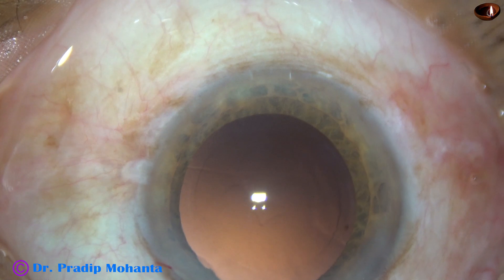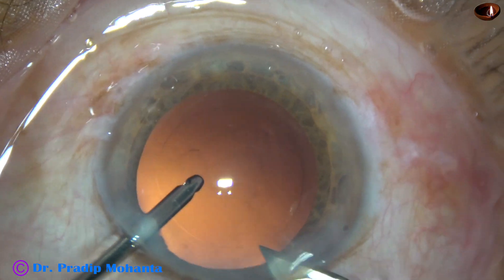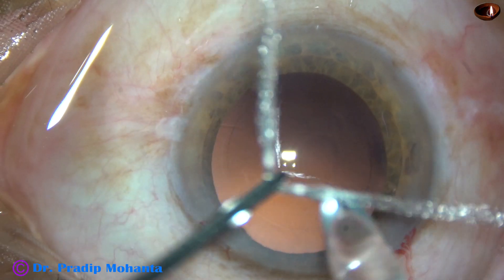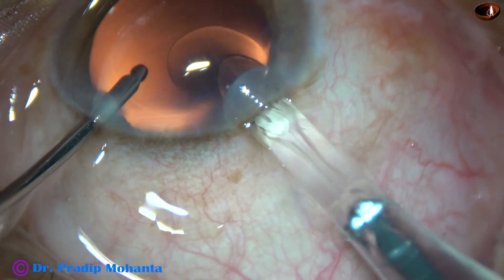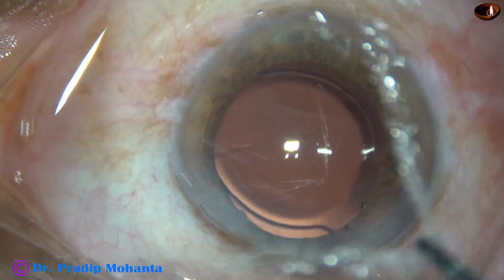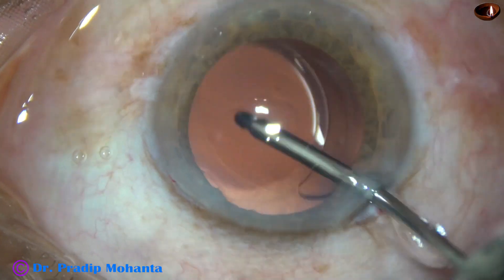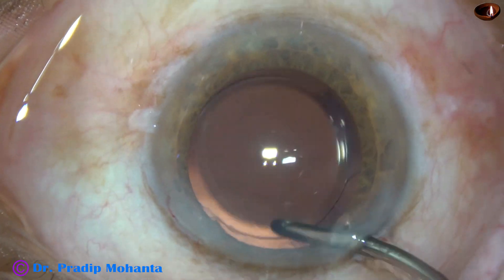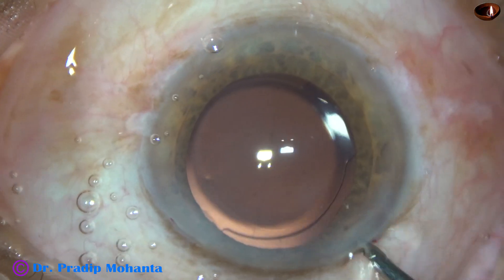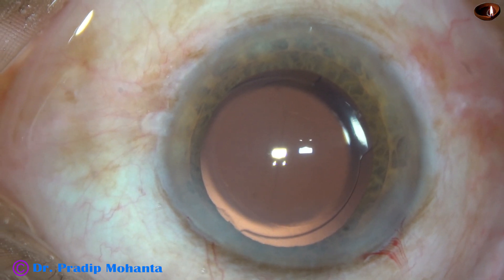And now I am going to use a cartridge injector to implant the intraocular lens. I enlarge the main wound a little bit, so the 2.8 mm incision becomes 3 mm. Here goes the intraocular lens. The lens is implanted keeping the anterior chamber formed by irrigation — this is known as hydro implantation. Keeping the anterior chamber formed by BSS during implantation of the intraocular lens. No viscoelastic is used. The advantage is we save a lot of time which would otherwise be dedicated to cleaning the viscoelastic.